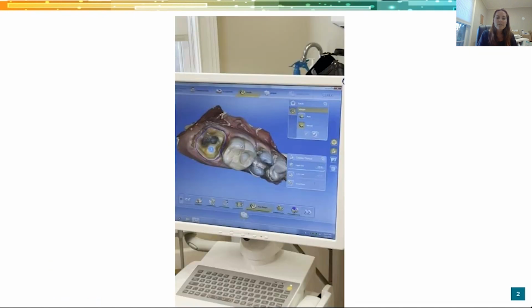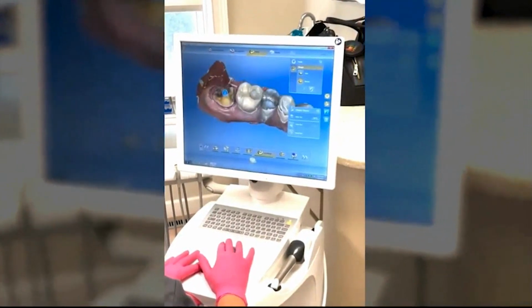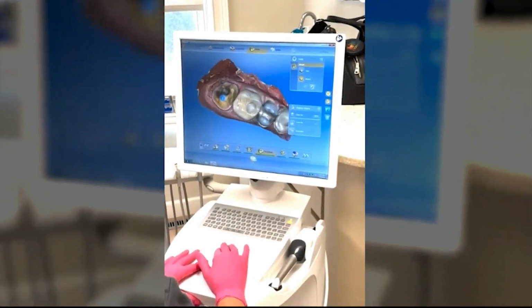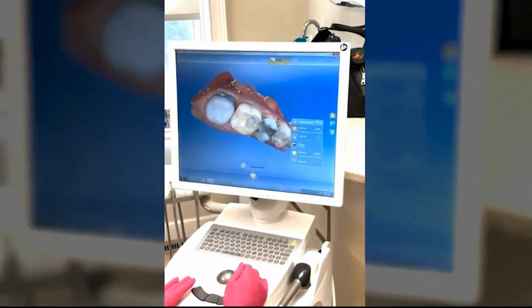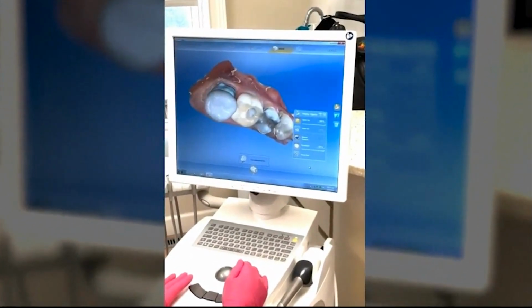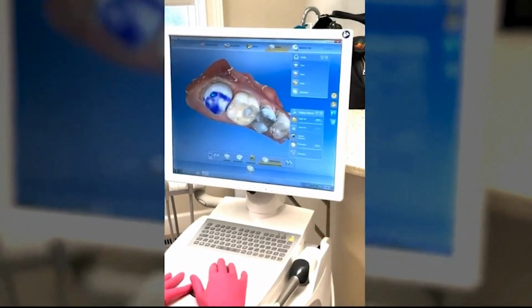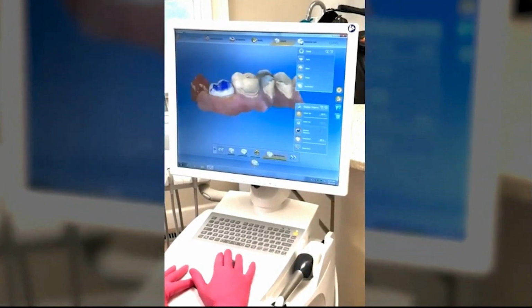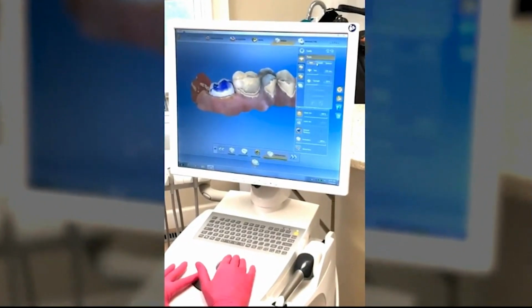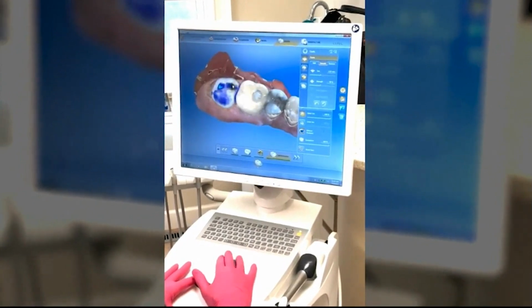And in this video here, the machine will outline your prep. That's that bluish purplish line around it. If you wanted to change it, you can go back and make sure that you get the margins properly. And then, like I said, you tell it ahead of time. So I told it I'm doing tooth number 2. So it puts the tooth number 2 into your prep, into occlusion. And then you can use the tools on the side to go back and modify your prep a little bit.